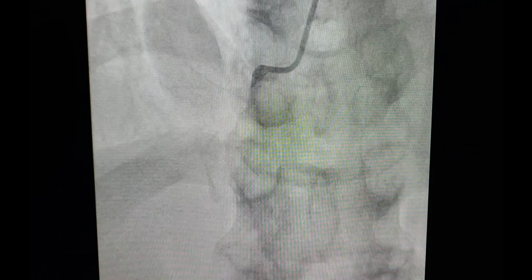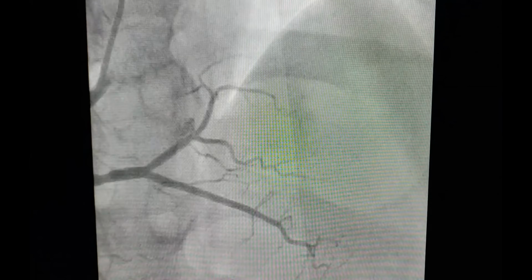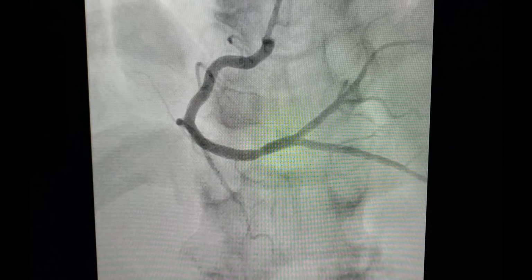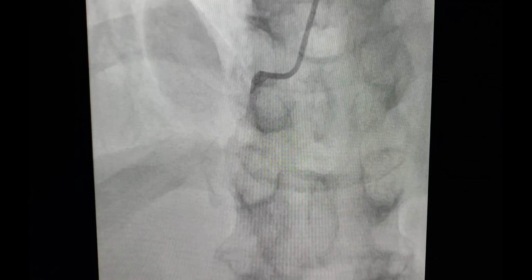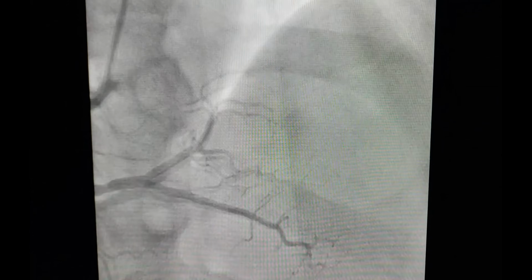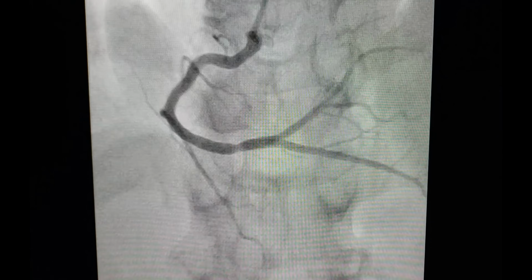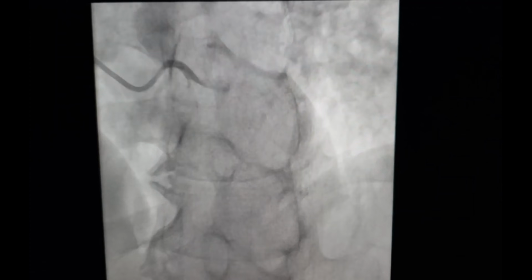So here's the TIG catheter. It went into the RCA first, so we started with the RCA. You definitely see there's a lesion in the distal RCA right before the bifurcation of the PLA and PDA. You see the acute marginal and RV branches look pretty good. There's a couple of different pictures we took of this, but definitely that lesion towards the end looks like a 30 or 40%er, that distal RCA.